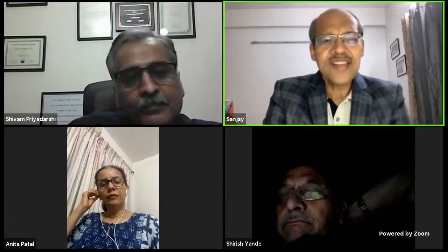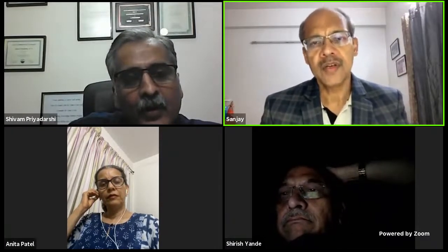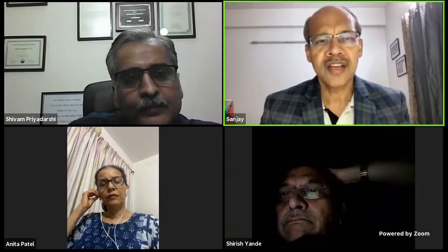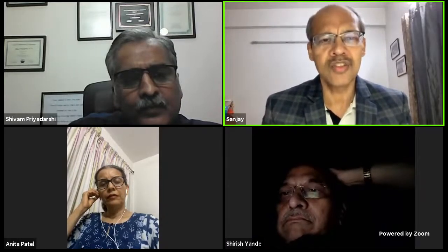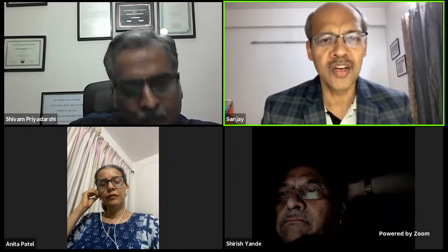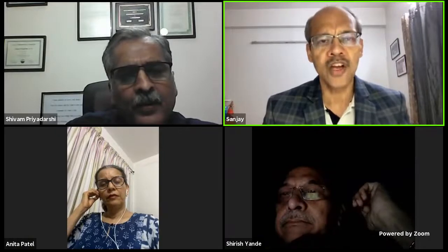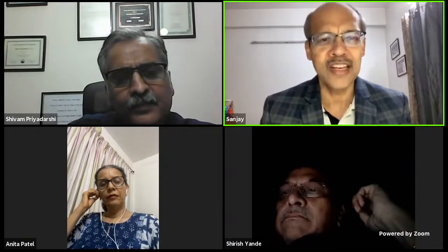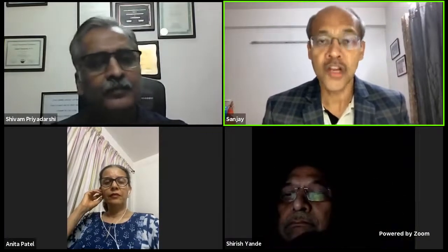Yes. Most of these are applicable to men rather than women, and the information that you get is at this point just not really good enough. You don't have good clinical correlation and so on. For the high-risk groups where you are looking at safety and so on, you don't have it. I get a feeling that at this point we are just not there in terms of non-invasive pressure measurements.